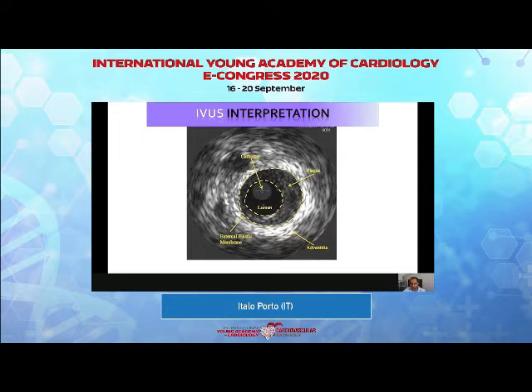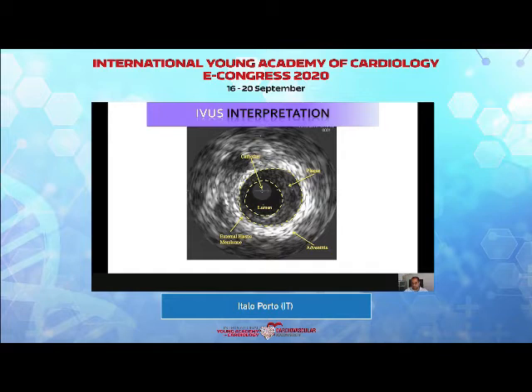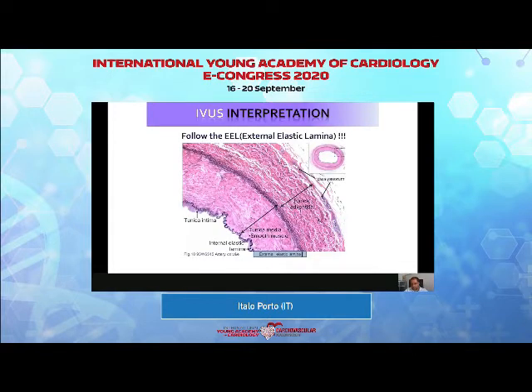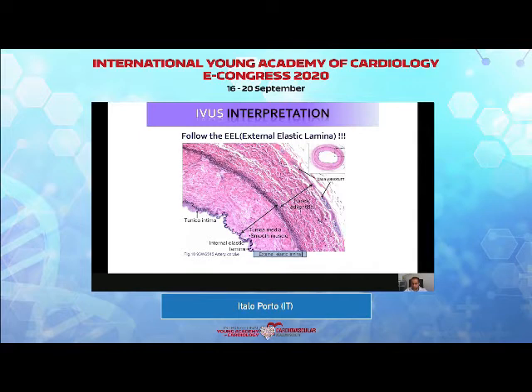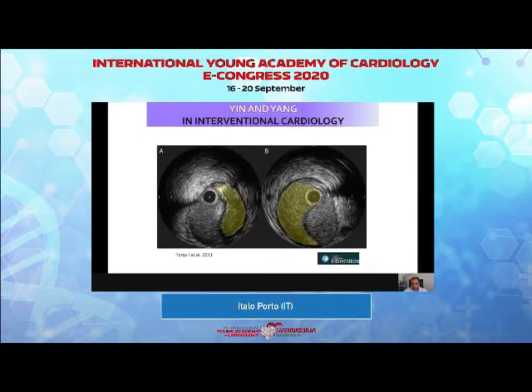What are the main features to look for in IVUS images? First, we need to identify the lumen and trace a polygon which is the lumen border. The second structure to identify is the external elastic membrane, or external elastic lamina. Looking at histology, we cannot see the intima properly — not even with OCT — but we can see the lumen, and we must identify the border between adventitia and media, meaning the external elastic lamina.